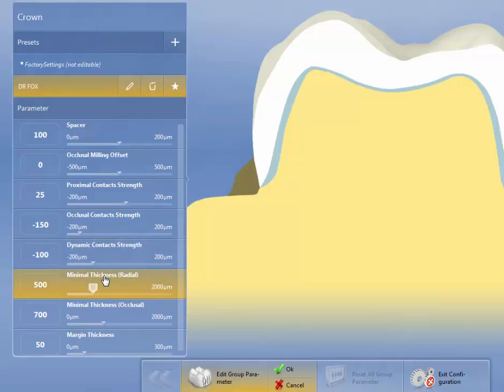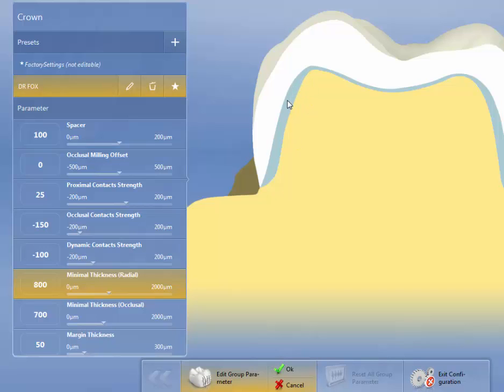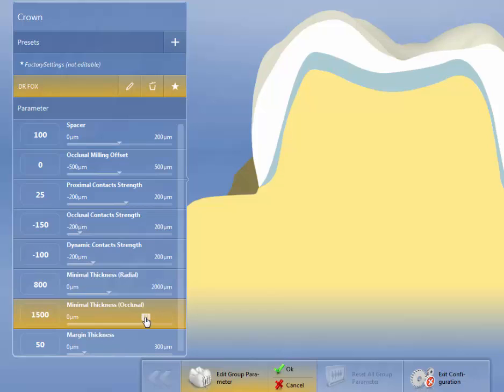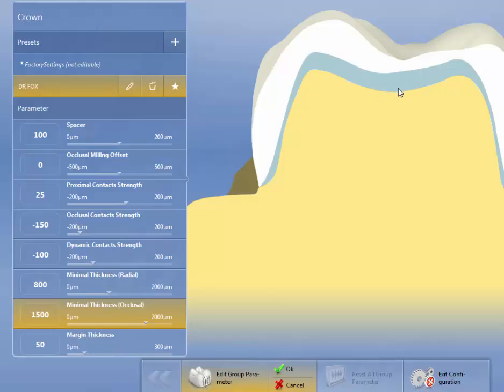Minimal thickness radial. I'm going to turn this up to about 800 microns. Ivoclar recommends that you try to get at least a millimeter of axial wall above the height of contour. The minimal thickness occlusal, they're very insistent that even though it's very strong, we need to do 1500 microns over cusp tips and the central fissure line. In order to get that, because we also have 100 microns of spacer, and it's measured from the tooth to the top, and it doesn't take into account the spacer, we're going to set this to 1600.